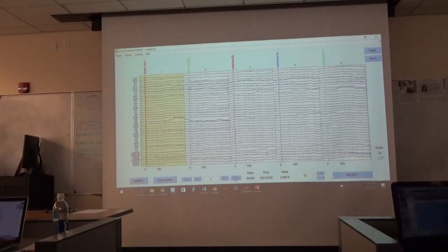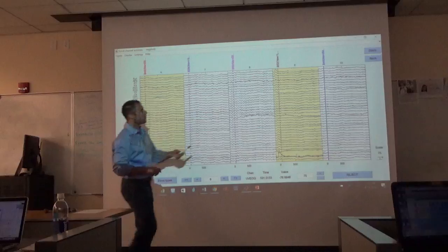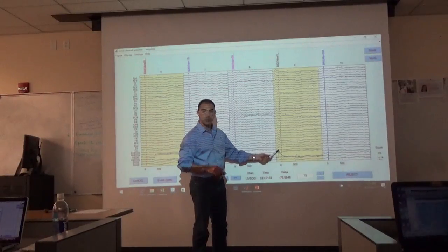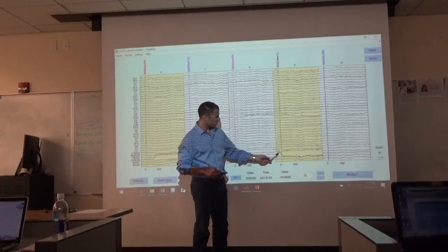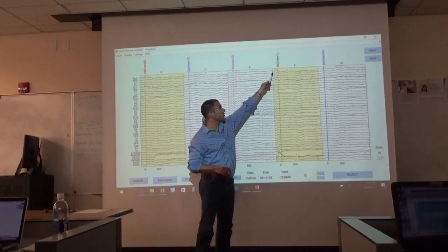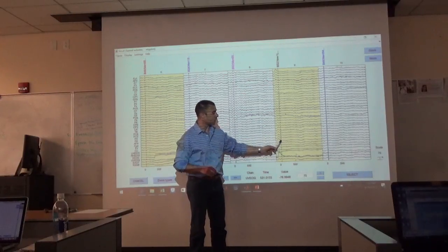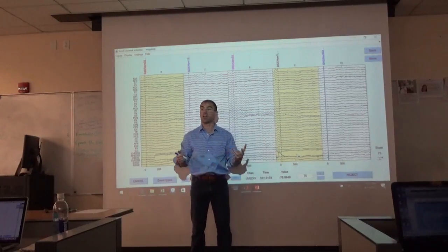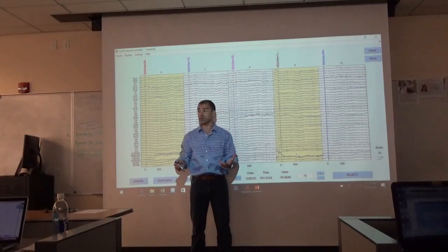and you can click the little double arrow, and we can find the trials. Oh, there's a blink. Look at that sucker. Trial 9. See that blink right there? Pre-stimulus? Can't have that sucker in there. See how it affected these frontal sites? So we want to highlight this. I should say this too. Anything you highlight in yellow is going to be rejected.